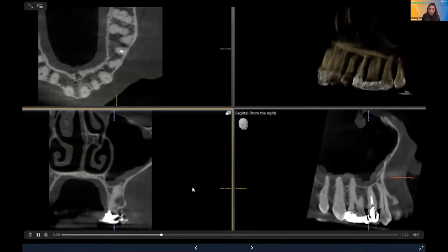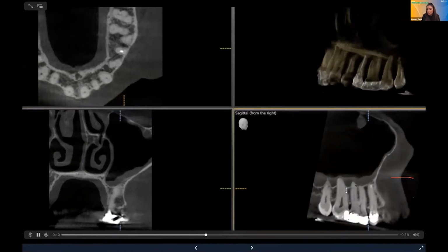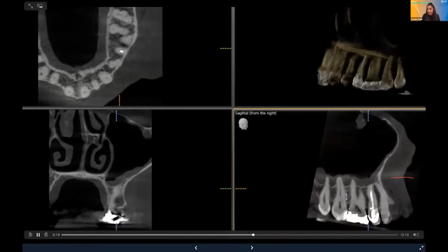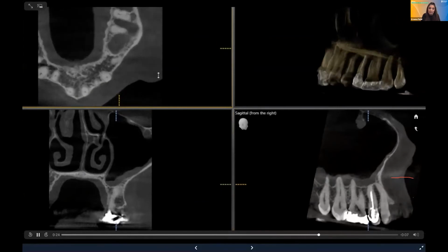This is the border of the sinus here and the membrane that we're seeing here. And again, no lesion with the 5 at all. Relatively, the sinus membrane is the same thickness throughout. So there's sort of no inflammation that we're detecting there at all.